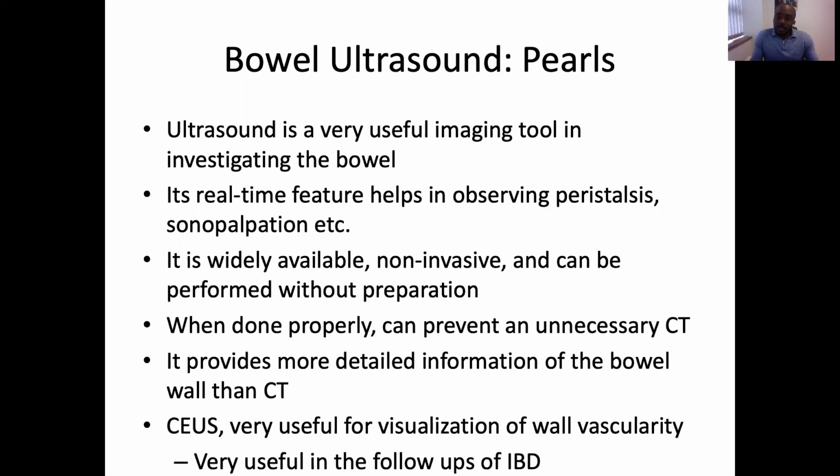Ultrasound is also widely available. Compared to its counterparts, ultrasound is quite cheaper. Ultrasound is non-invasive, particularly transabdominal ultrasound, and it can be performed usually without preparation. So in an acute case, in an emergency setting where a patient turns up with significant abdominal pain and the doctors are trying to figure out what's going on, you can instantly send the patient down to ultrasound to have them examined without any prior preparation.